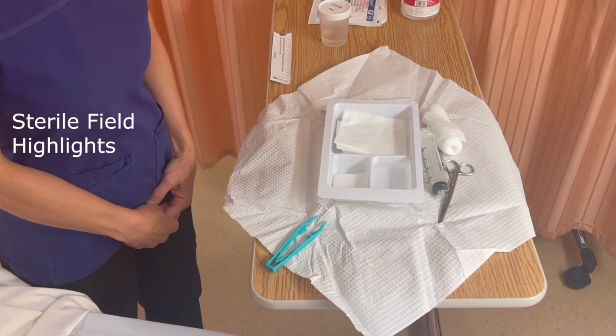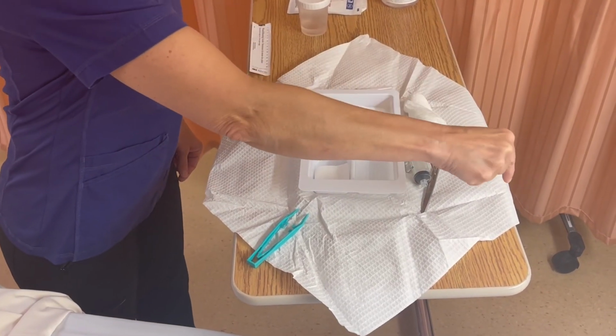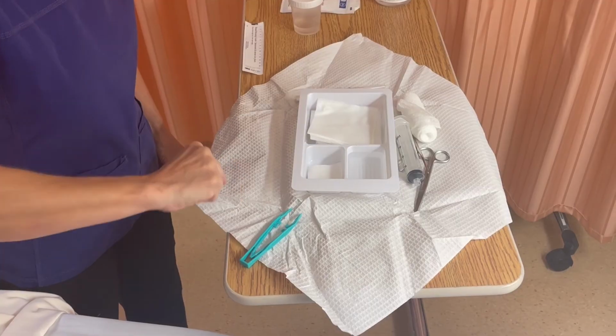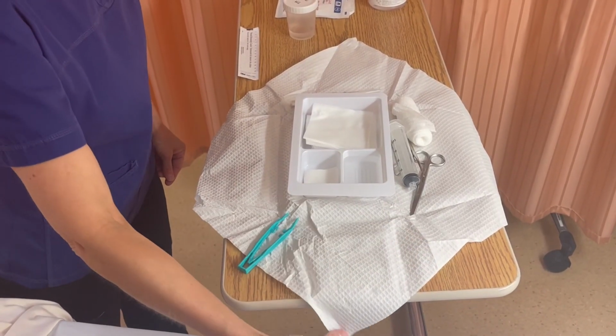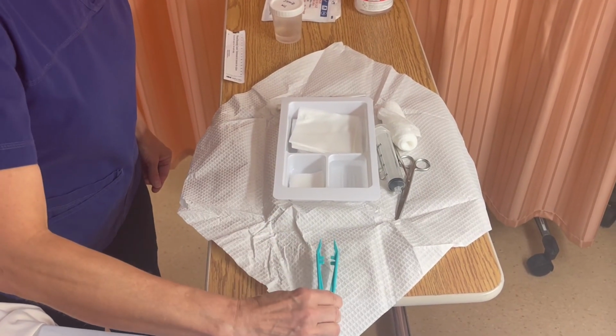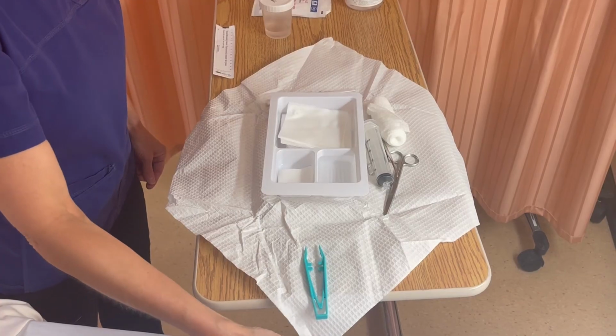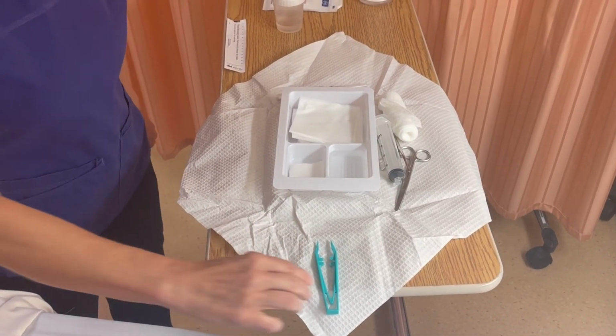Some key features of the sterile field include the 1-inch border. So there's 1 inch here, here, here. Actually, the 1-inch border would cut off, as you can see, where the end of the table is. So if I were to put my forceps down, I could put them down there, but then they're at that point in the 1-inch border.